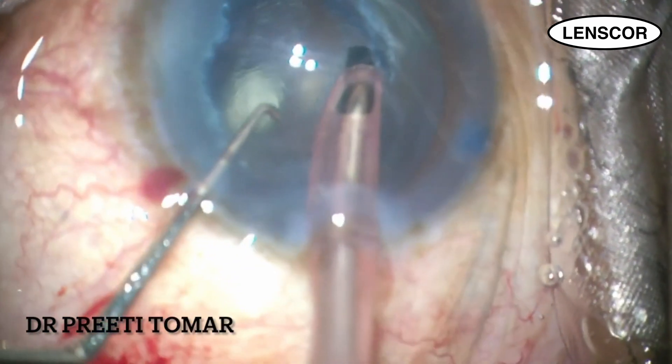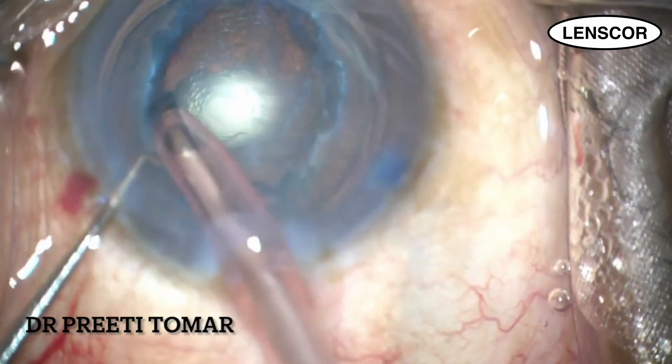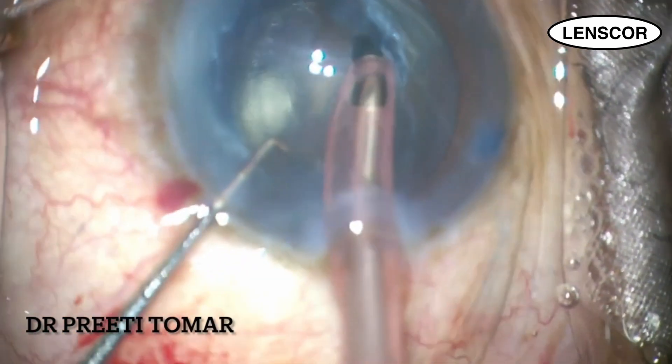Once I have an adequate depth of the trench, I engage one side of the endonucleus onto the phaco probe and on low power itself, the nuclear fragments are impaled and emulsified subsequently.